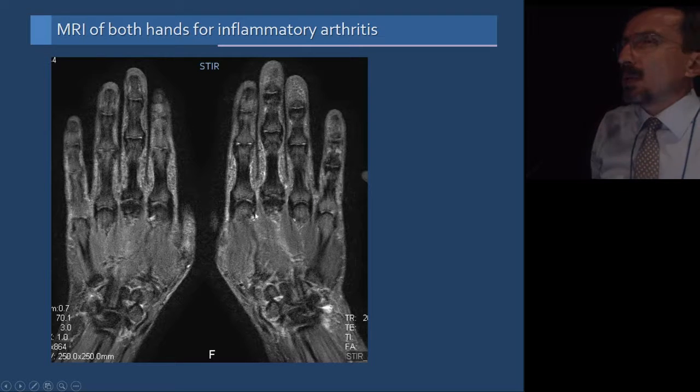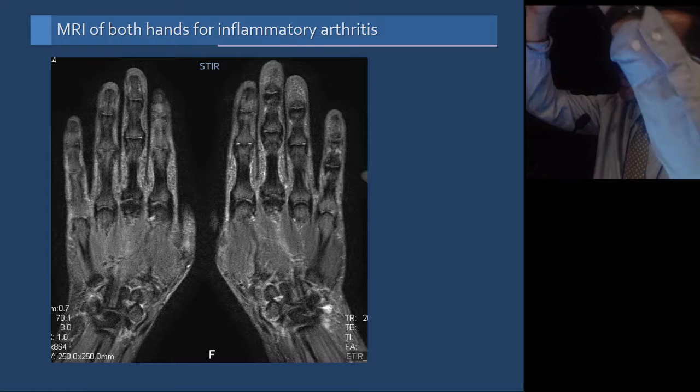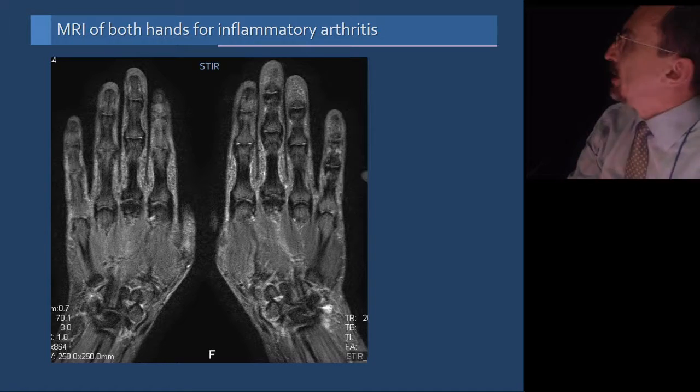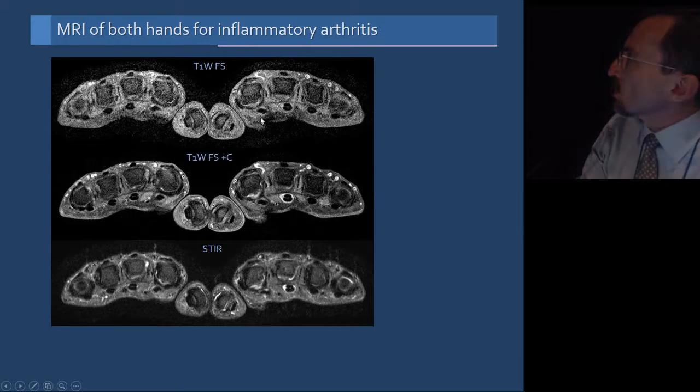But as you imagine, if you can have the hands on prayer position, there is even a more decrease in the imaging volume, so you can have a more detailed imaging with the prayer position rather than this Superman position, if you will, like this here.